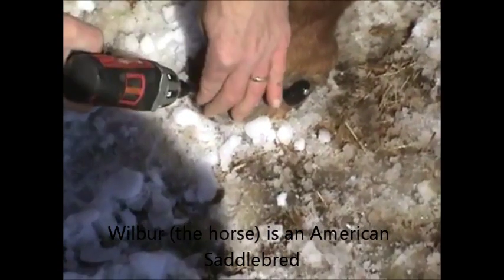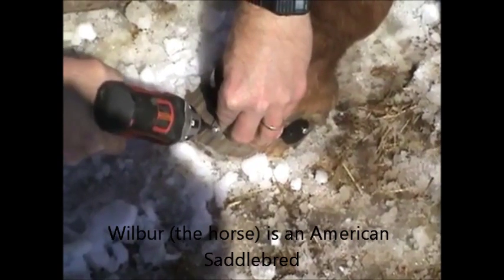He's not flinched, he's not jumped. There are a lot of people who worry about these screws because they're 3/8-inch, but they never hit anything sensitive. This guy's got nice thick hoof walls. If you've got one with a thinner wall, then you use the smaller screws. With a horse this size, you'd always be able to use the 3/8s. On a mini, I've done both — with that rubber coating on, the screws were a little thicker so I've been using the 3/8s. We actually started putting four 3/8 screws in each mini bag along with the 14 other ones, so they got an anchor — because we had them pulling loose when tightening since they weren't in far enough.